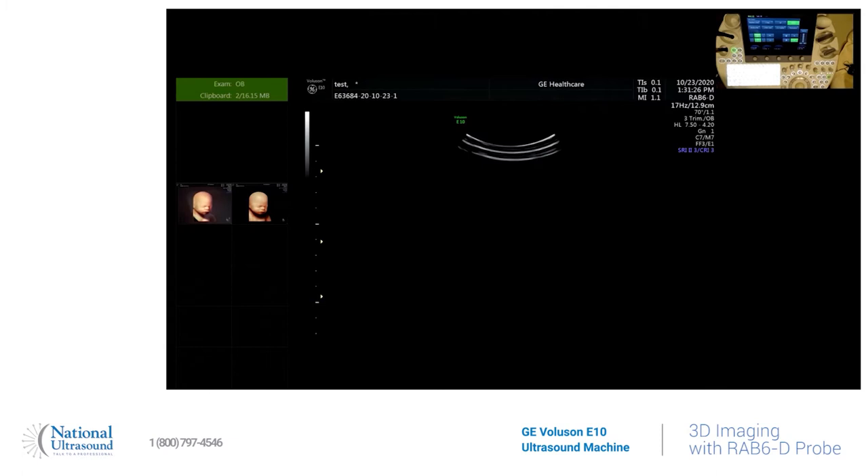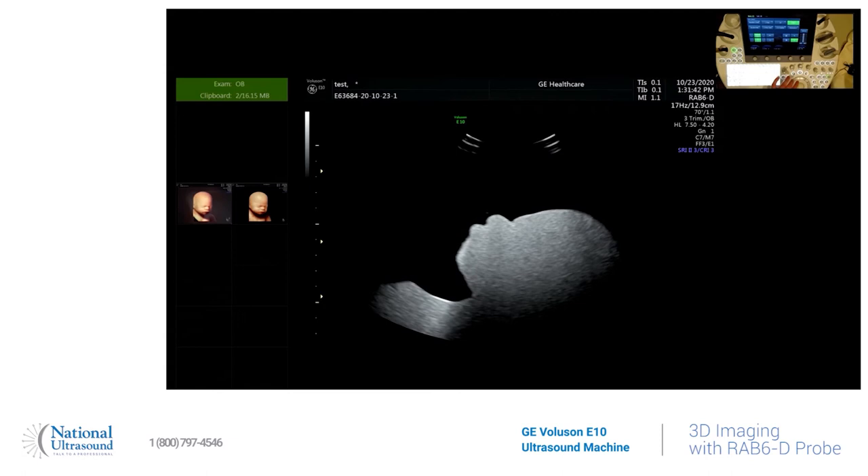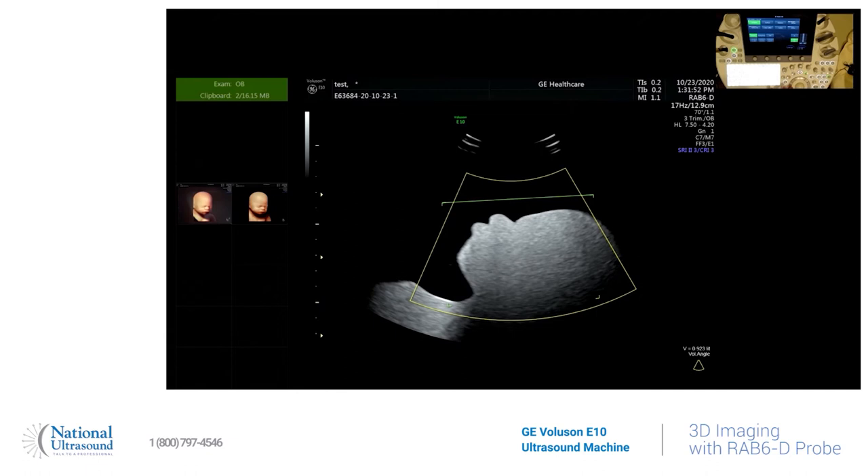We are using the 3D probe, and as you can see I am scanning a fetus that's about 36 weeks along. You get a perfect profile picture, and then on your platform you hit the 3D button. You move your point of interest box how you want to. You can also through the toggle keys beside the ball, you can hit down the curvature to reduce some of the artifact — you set it how you want it.